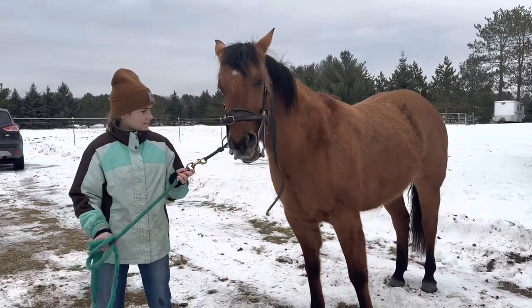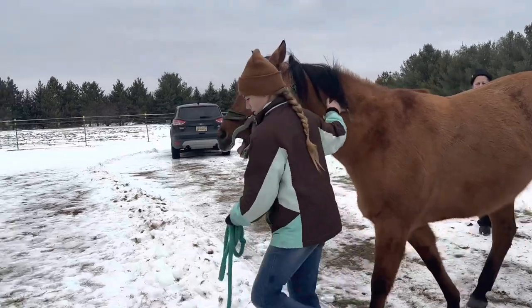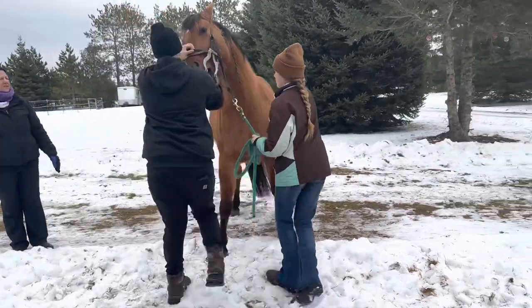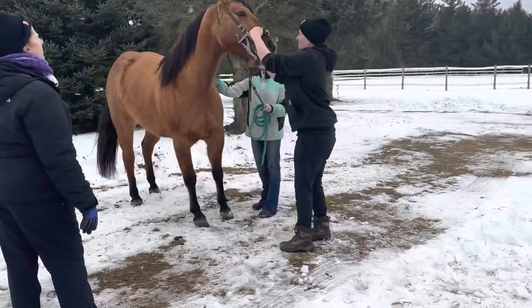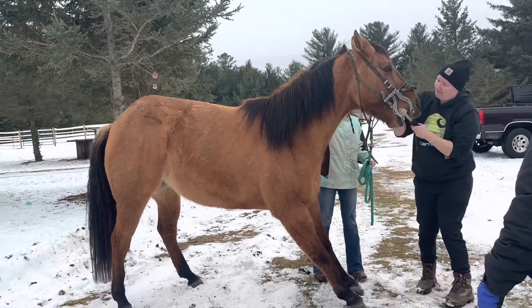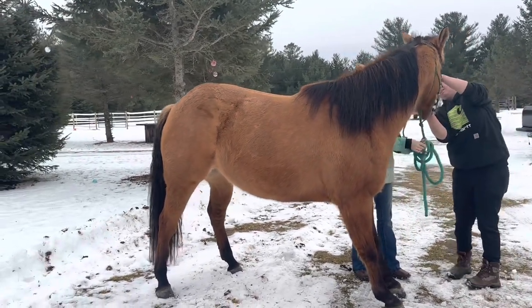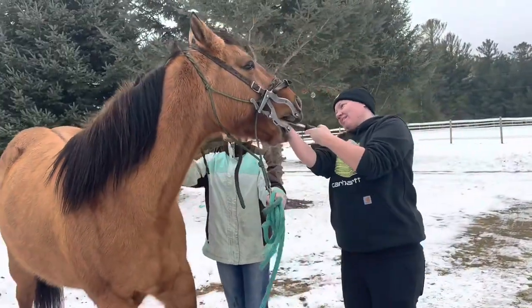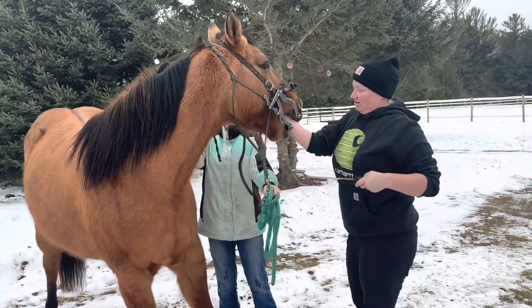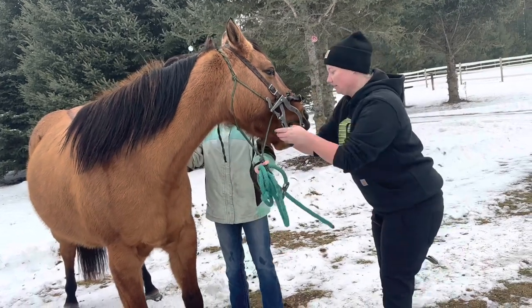If you want, you can walk her back up. It does not want to move. Come on, pretty Willow. Good girl. Kind of see when those points do come off, it smooths right out. She has huge points. A lot of times the younger horses have really big points because their teeth are really young, so they're really healthy.